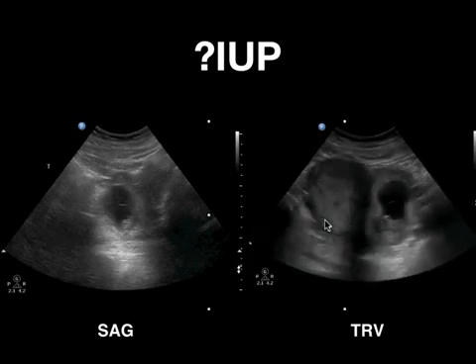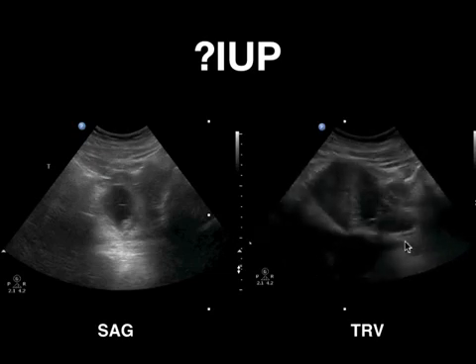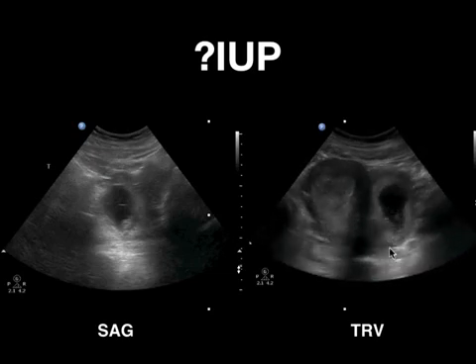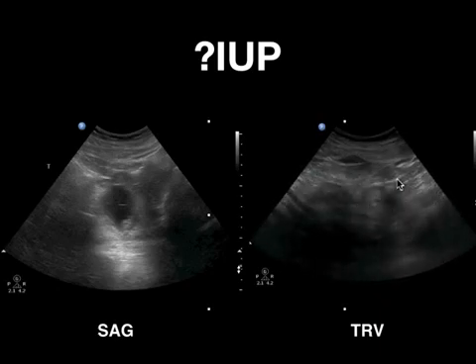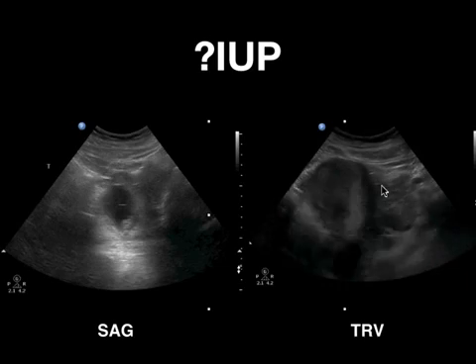You can see on this sweep, here you've got uterus, here's pregnancy, but is this the right horn and this the left horn of a patient with a bicornuate uterus? If you take a close look here, there's no myometrium bordering this pregnancy. There's no border here at all. So that would go against this being an intrauterine pregnancy. This was a patient who had an ectopic pregnancy.